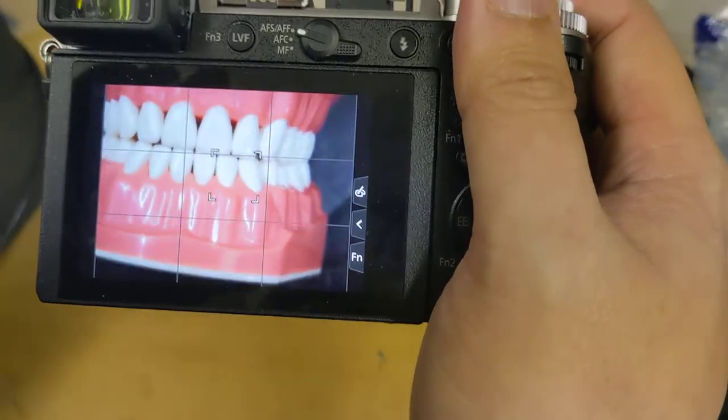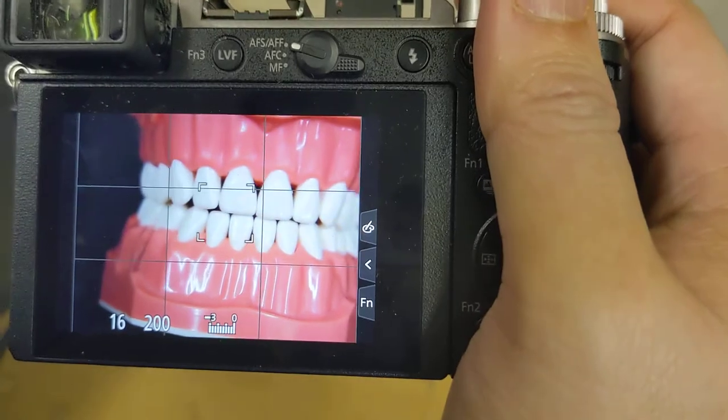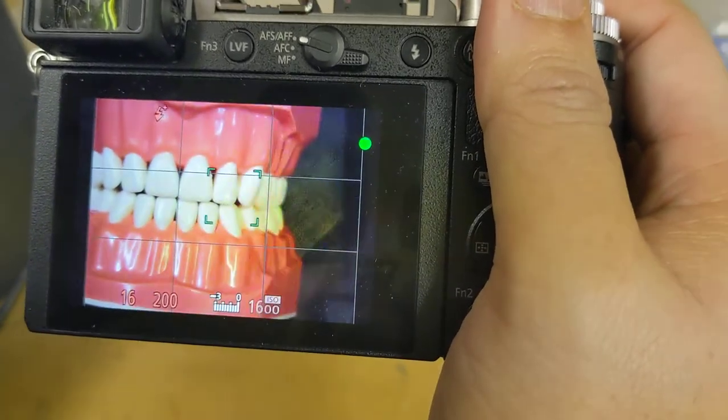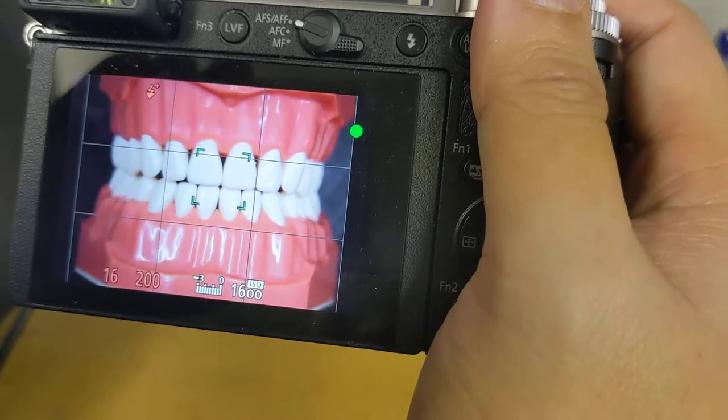So let's start by not focusing on the centrals like every rookie does. What you actually want to do is focus on the lateral, or even better yet the canine, and then slide over, center your shot, and take it.